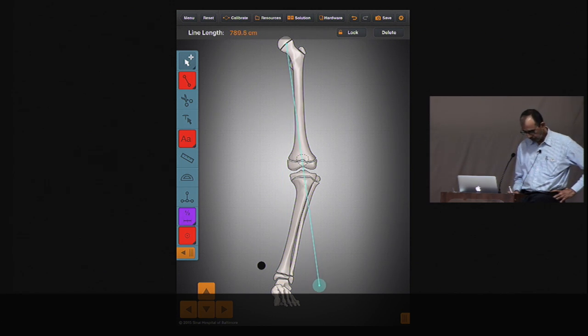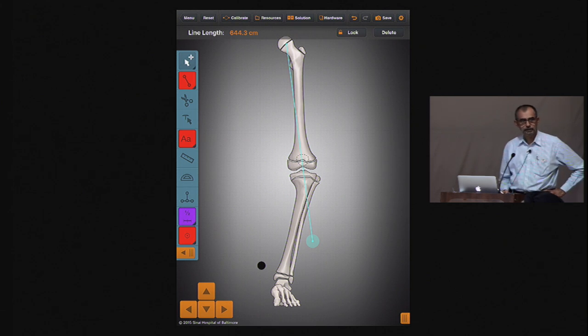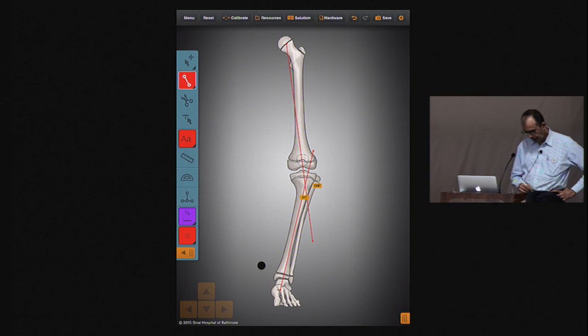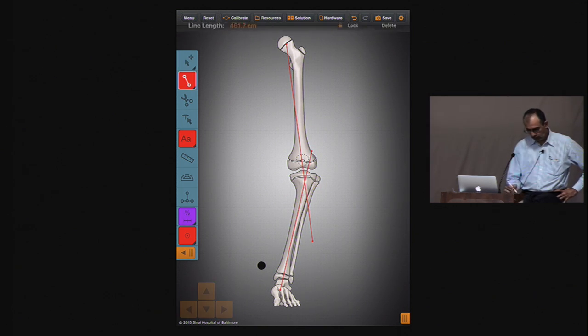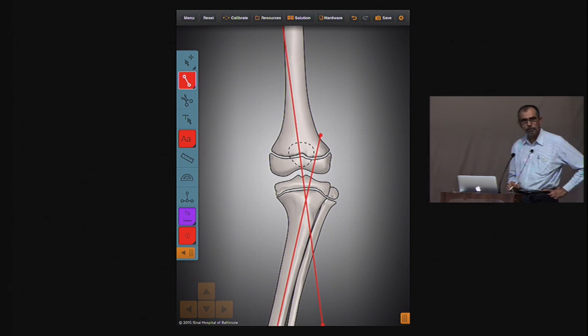So we will draw the proximal axis by extending the femoral axis. So that's the proximal axis, alright. And the distal axis I can draw 90 degrees to the tibial plateau. That's also the mid diaphyseal line of the distal fragment. So now my CORA, so the CORA is now right up over there.